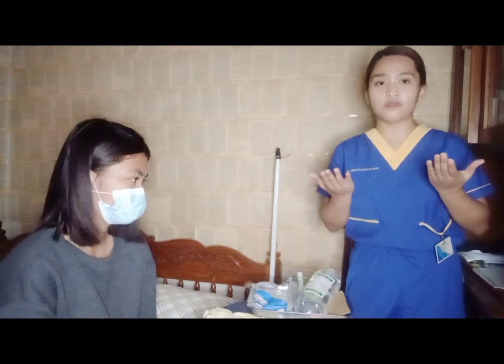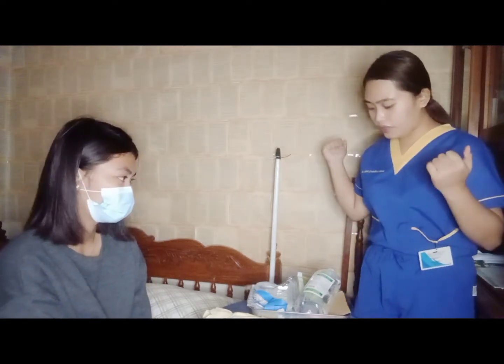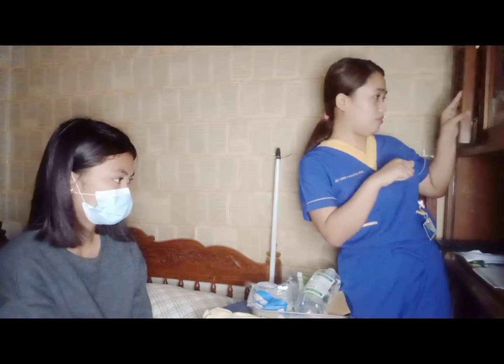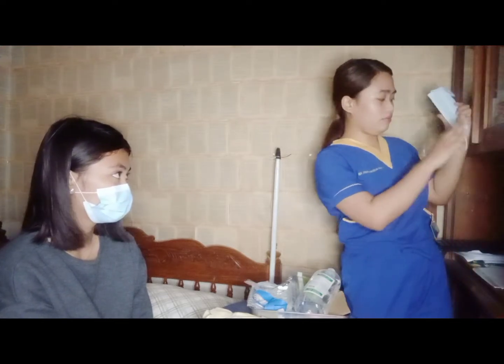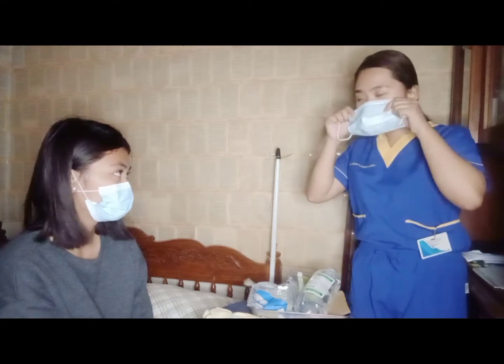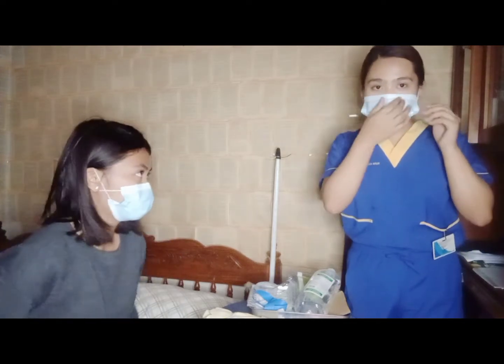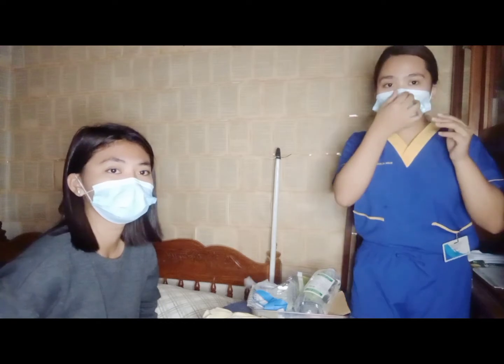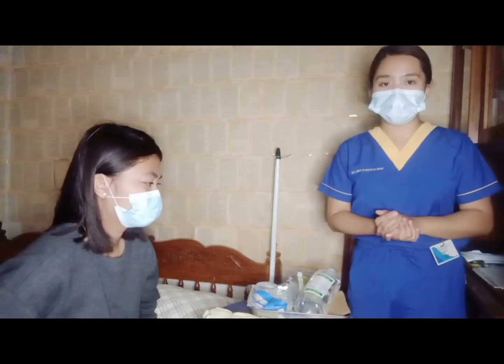Assume that I've already washed my hands. And now, I'm going to put on a face mask. The rationale for this is to prevent contamination and transmission of microorganisms.